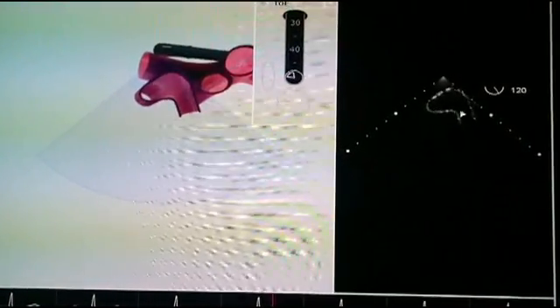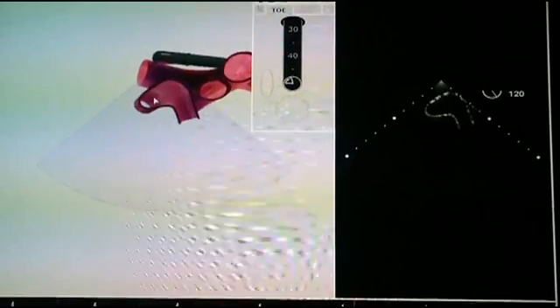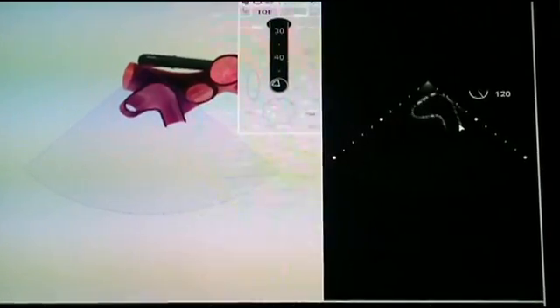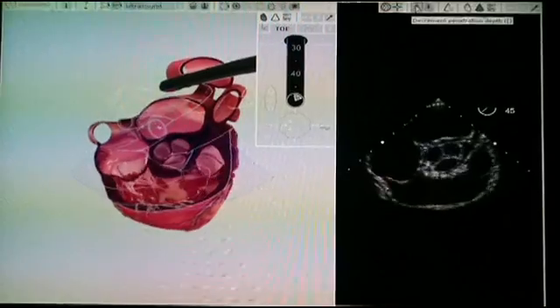Step by step, now I'm cutting here the left atrium and here's the left atrial appendage. I will continue rotating to the left of the patient, and then I will cut both pulmonary veins at the same time. I can get the left upper pulmonary vein and left lower pulmonary vein — here's the left upper and left lower — in an inverted V-shaped pattern. This is a very easy way to get both left pulmonary veins at the same time. So: 120 degrees and then to the extreme left of the patient, or anti-clockwise rotation.